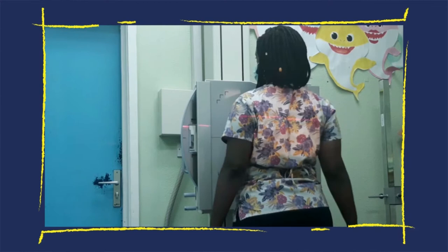Next, the patient will need to roll their shoulders forward. This will help the scapula get out of the way and move laterally away from the chest wall. You'll know you had a great position in terms of shoulder rolling because in the x-ray you won't see the scapula within the lung field. This is important because if the patient has a pneumothorax, the scapula could block things. One way to achieve this is to have the patient put their hands on the hips and roll the arms forward. Another way is to have them hug the board while rolling the shoulders, or just have the arms at the chest if they can't assume the other positions.